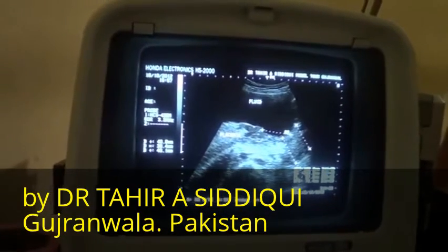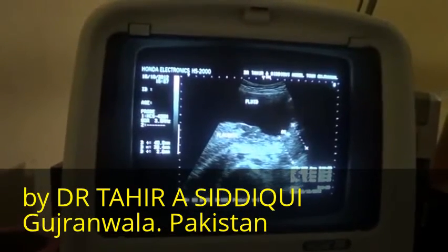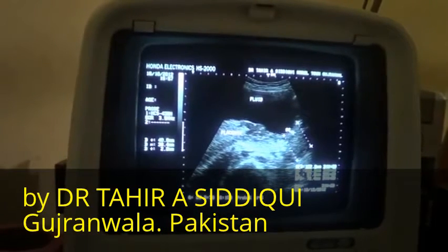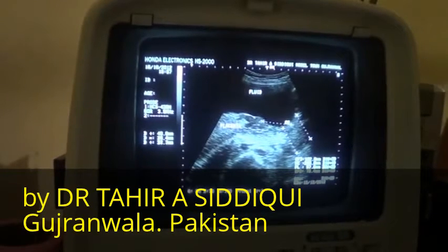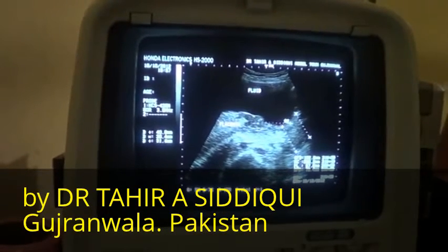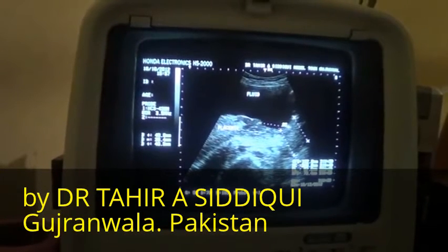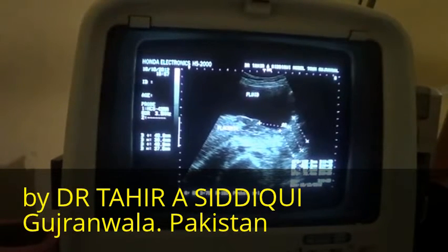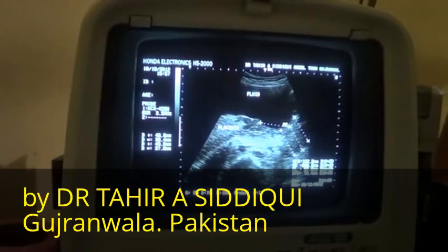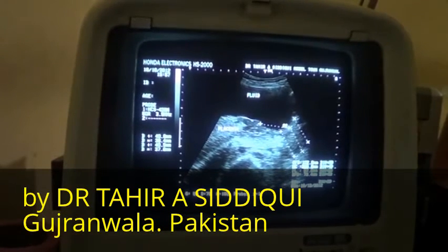The distance between the internal os, this region, this being the cervix, and this being the lower end of the placenta, is approximately 40 millimeters, and the length of the cervix is 37.6 millimeters and is within normal dimensions.